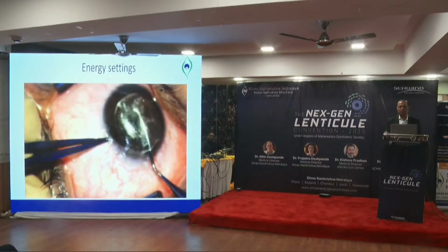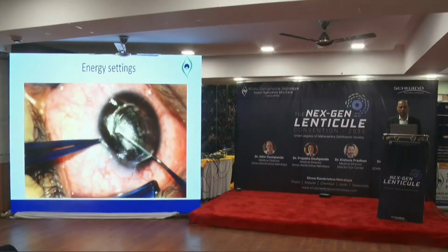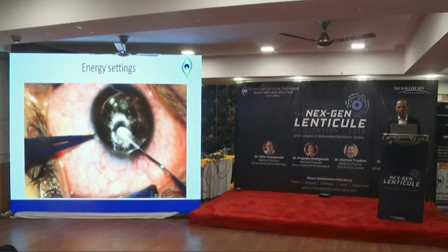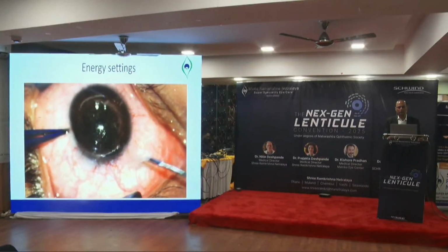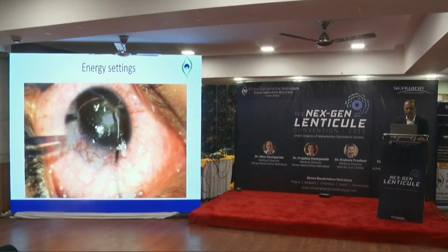Now you see this number of swipes is going to delay your visual recovery. And now you see me going into the posterior plane. When you are going posterior, if you have too much resistance, you can also have false planes, because if you put too much force, you can enter the wrong plane and you are going to have a problem. So this was the energy setting, but eventually in a few cases we got it right.